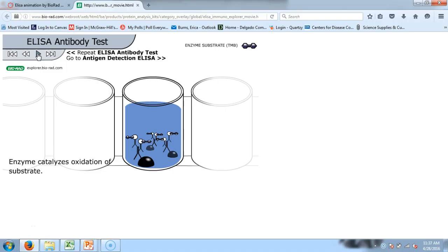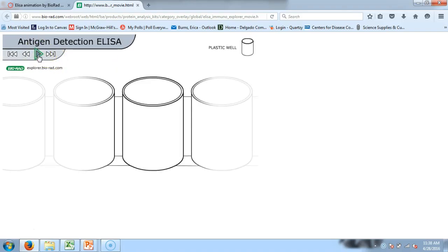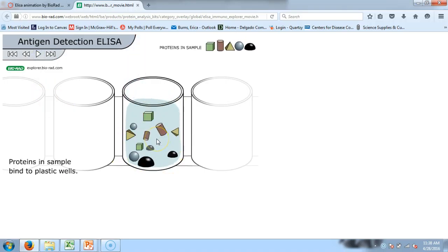Your hormone's the antigen. The test kit has a primary antibody just for that. Then a secondary to bind to that antibody if the antigen was present, right? You got antigen, you get antibody, enzyme, substrate, color change. Right? It's always those 4 things lined up. So that pregnancy test, as I said, right? You're starting out with all these possible things in that, right? So bunch of different things.